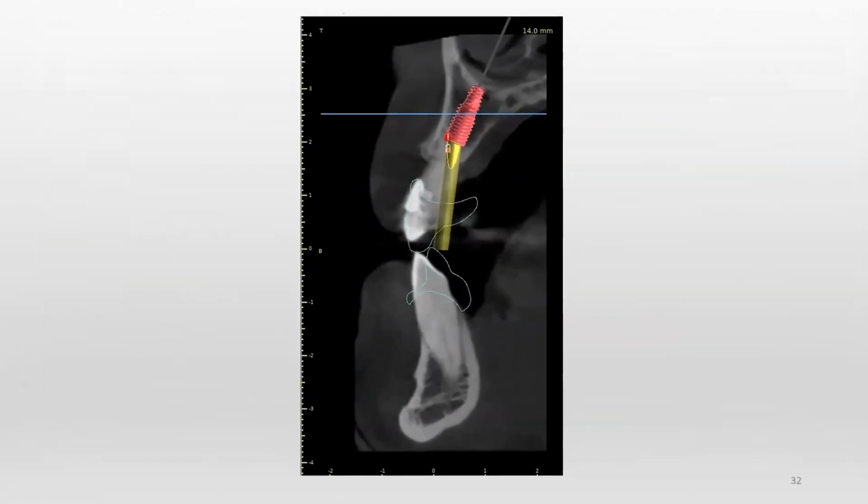This is the implant position. Now we can see the green line here outline. This is the prosthetic line here, and the implant emerging, the access hole emerging from the palatal aspect of the prosthesis. So everything is planned, and we come to know also what is the angulation of the multi-unit abutment which has to be used, whether it's 17 degrees, 25 degrees, or 30 degrees. So we come to know prior to the surgery, and we keep them ready on the table at the time of the procedure.